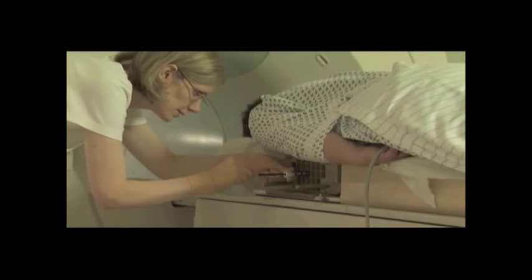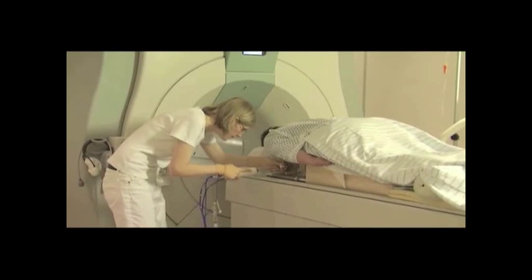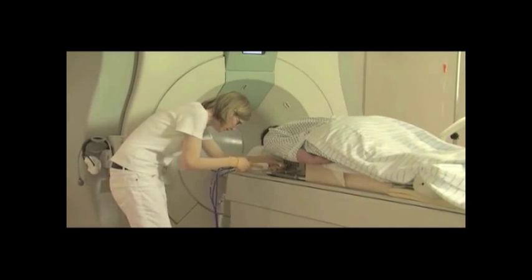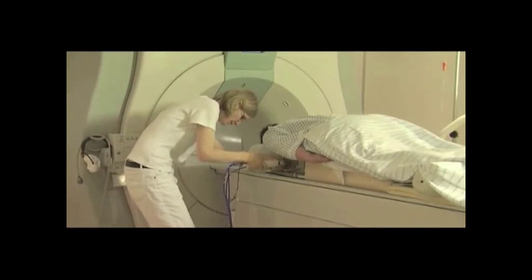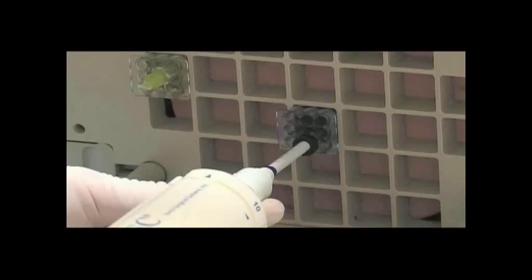Remove the localizing obturator from the introducer sheath. Place the ATEC MRI handpiece into the introducer sheath on the desired starting clock position indicated by the numbers on the handpiece. The flat portion of the handpiece correlates to the cutting aperture.